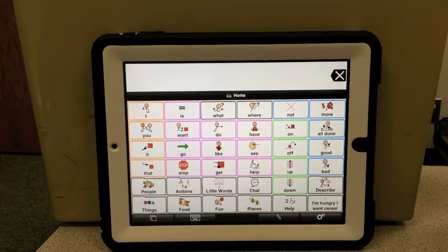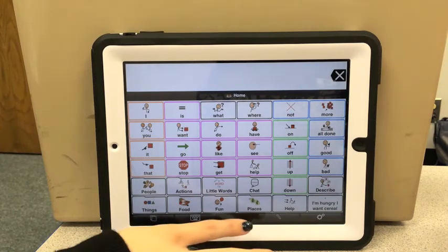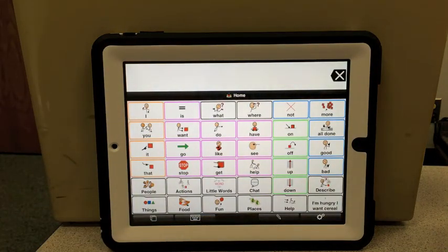Combining with Bluetooth, you could use the iPad in mirroring mode and the iPhone or iPod Touch as a controller. If you want to connect to the stereo, there is a Panasonic compact stereo system that allows you to control the stereo through an app on the iPad. And also there are internet radio and streaming apps available through iTunes.